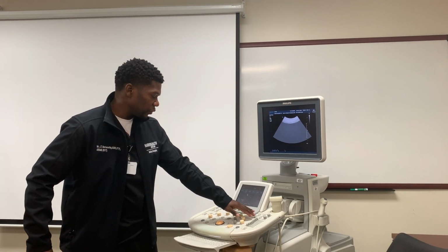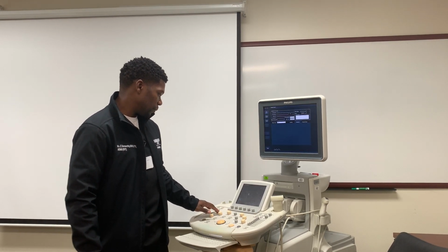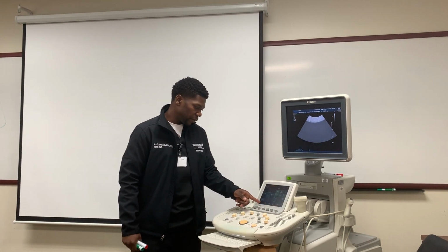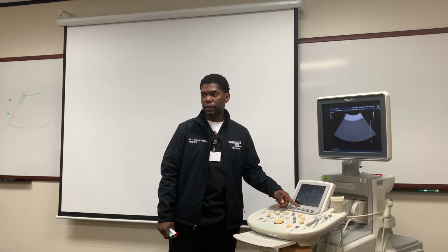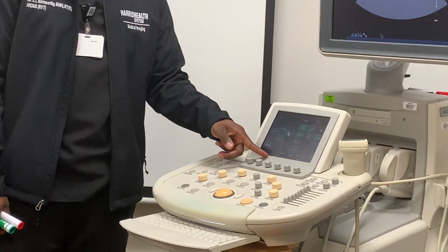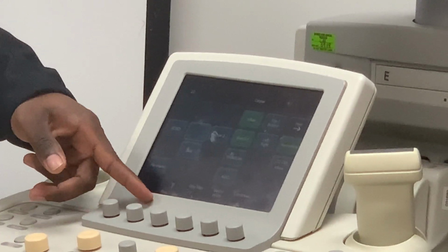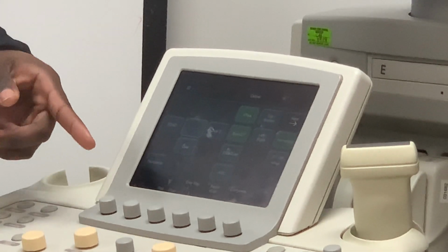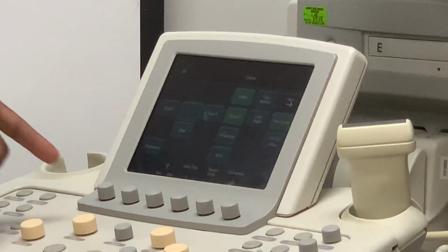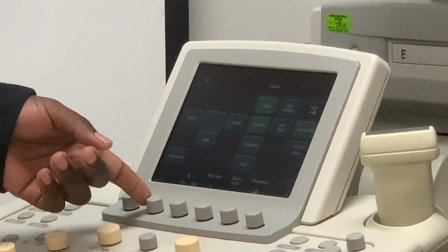But also remember I told you right here, guys, you can sacrifice your speed right here. Right here you see where it says resolution and speed. That's kind of like, do you want your image to be acquired faster, meaning better speed, or do you want higher resolution? It's a toggle switch too. It's always in the middle, but you can change it to whichever side you want to.